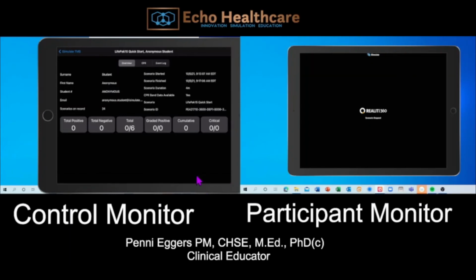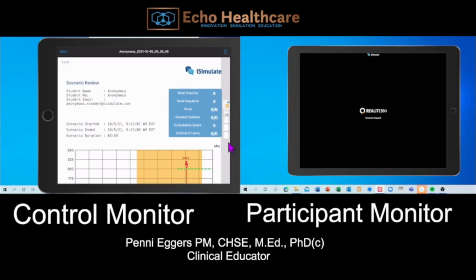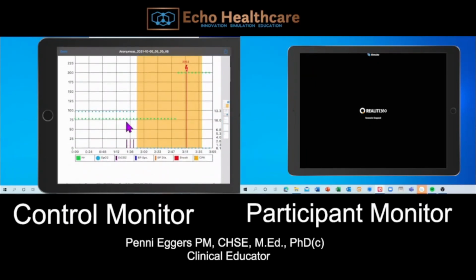So let's check out the PDF. Here is, once again, a more detailed debriefing tool. You have the student's name. Once again, highlighted in the blue corresponds with those checklists. You have when the scenario started, ended, the duration. This graph gives you a depiction, with a legend of what each of the colors mean. So this is the heart rate, this is your O2 sats, et cetera, and the orange, or the brown, is going to be when CPR was stopped and started, and any critical interventions. Here it shows you that I gave a shock at this particular point in time.